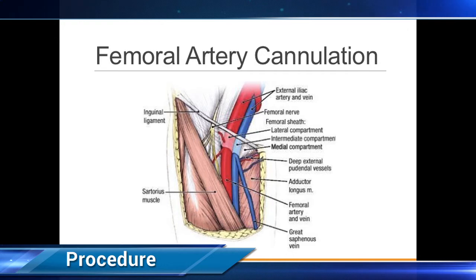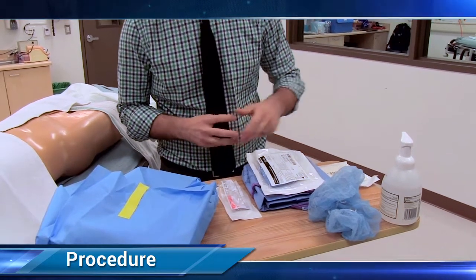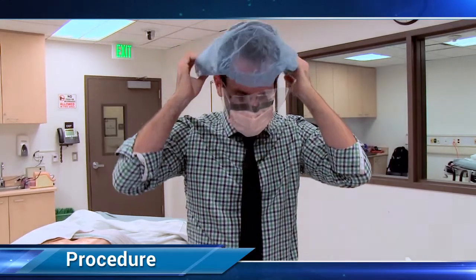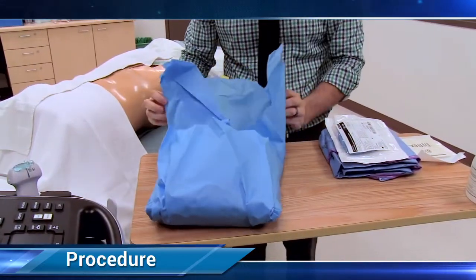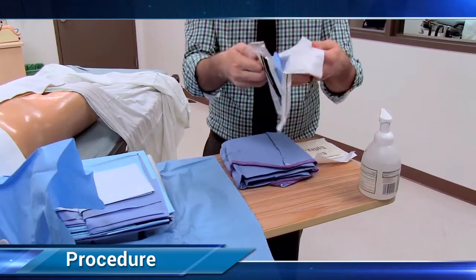The femoral catheter is also higher risk for catheter-related bloodstream infections, so full sterile protection is used just as in central venous catheter placement. This includes face mask, hat, the chlorhexidine skin prep, hand sanitizer. Then open the kit in a sterile fashion, including placement of a sterile probe cover into the field.